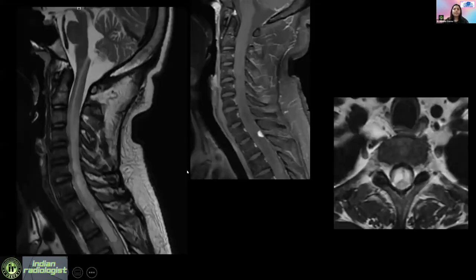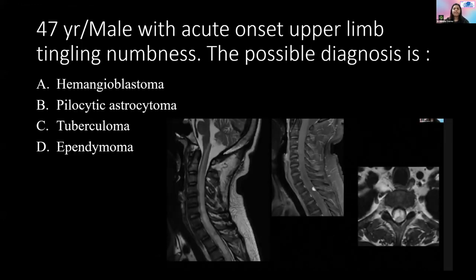Now this is the second question. You can see sagittal T2, post-contrast T1, and axial images on your screen. What is your possible diagnosis? The patient is a 47-year-old male with complaints of acute-onset upper limb tingling and numbness.